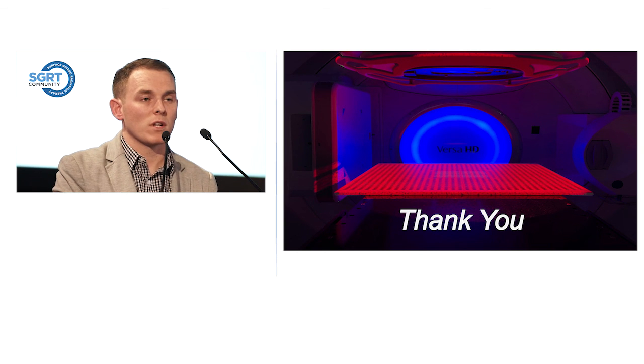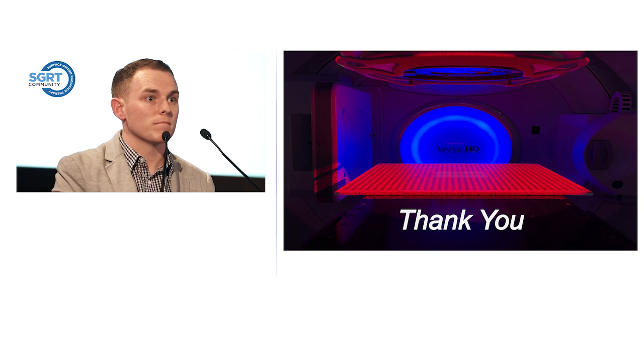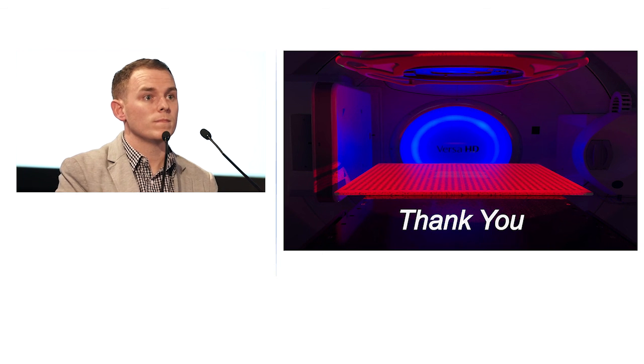Yes, I think using Align RT to monitor the patient to an accuracy of, say, for example, 3 mils in translations is a lot better than what our current practice was of using CCTV to monitor the patient. So the beam will terminate if they move, if they arch their back, for example, on free breathing breast. So yeah, I think it's definitely a benefit. Okay, thanks.